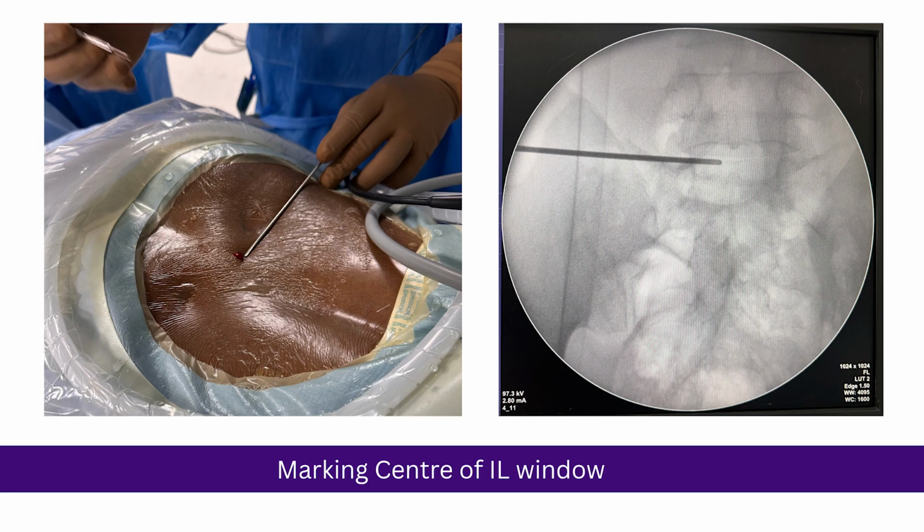You usually start the ligamentum flavum resection from the midline. Near the midline, the dura is far away from the ligamentum flavum, and the epidural fat lies in between. So if you take the first bite towards the midline, there is very little chance that you are going to damage the dura.